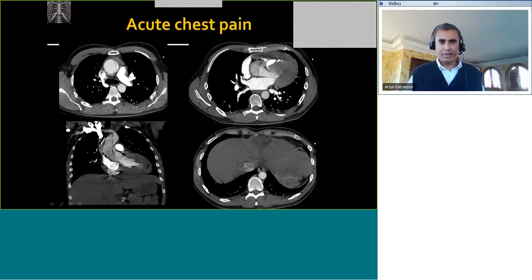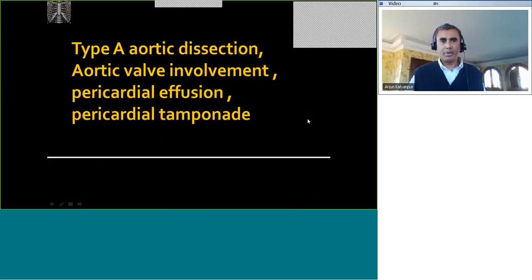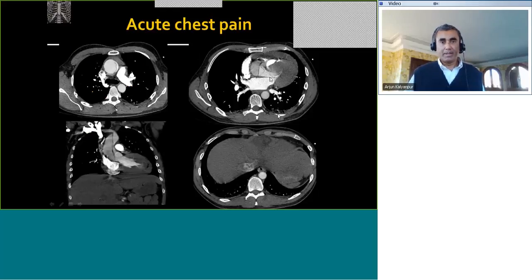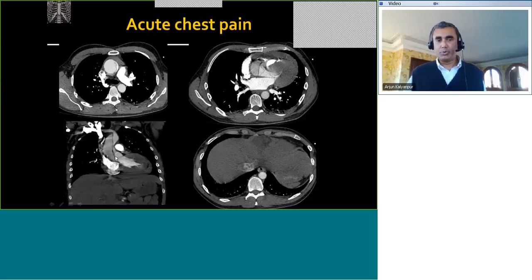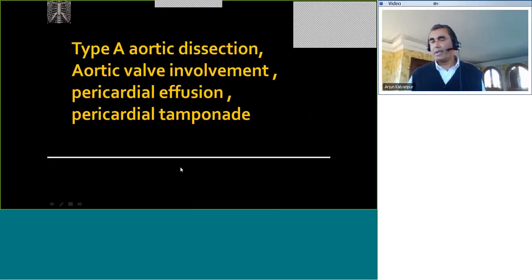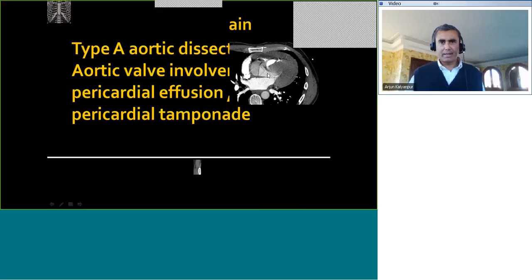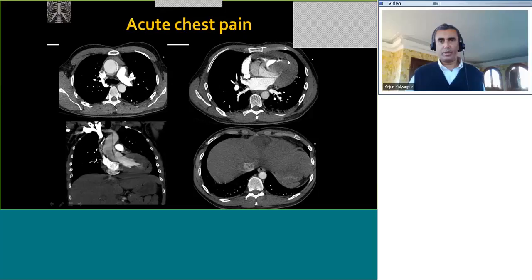Going one step further and looking down into the abdomen, we see reflux of venous contrast into the IVC and its branches, which tells us this patient is actually going into tamponade. This is also shown by the fact that the right ventricular size is quite small. The aortic valve is also dilated, suggesting some degree of aortic insufficiency. The fact that the dissection extends to the aortic valve — extending below the sinuses of Valsalva — needs to be communicated to the clinician. This is pattern detection: we go beyond the diagnosis to look for complications, pericardial effusion, hemopericardium, and secondary signs of cardiac tamponade.